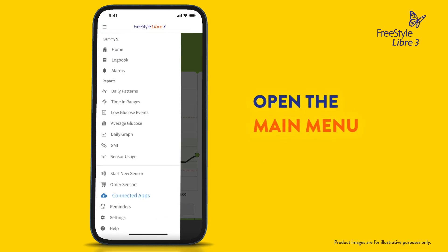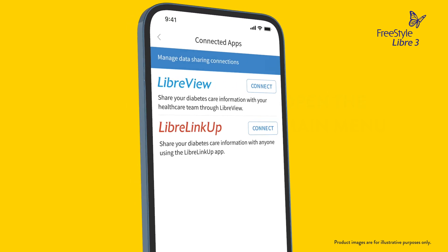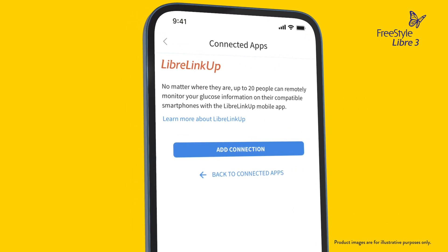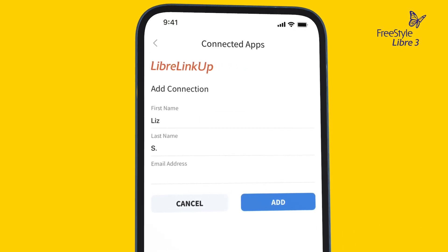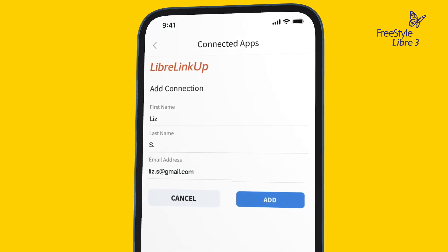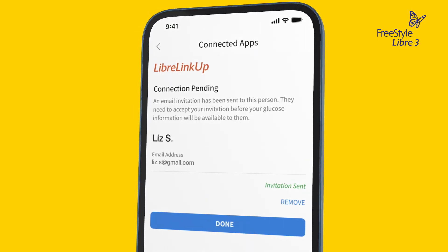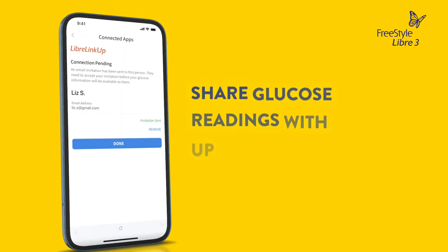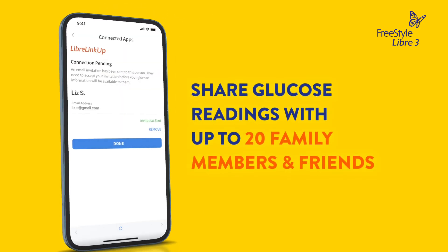Tap Connected Apps. Tap Connect or Manage in LibreLinkUp. Tap Add Connection. Enter the name and email address of the person you want to share your glucose readings with, then tap Add. They will receive an email invitation to download LibreLinkUp and connect. You can share glucose readings with up to 20 family members and friends.